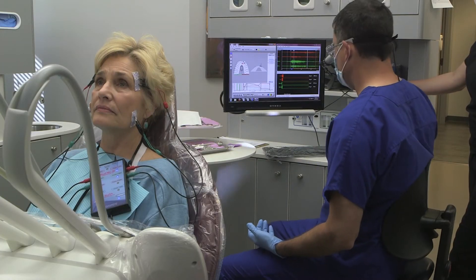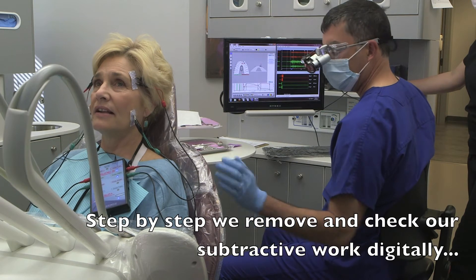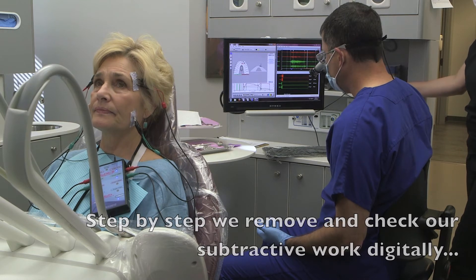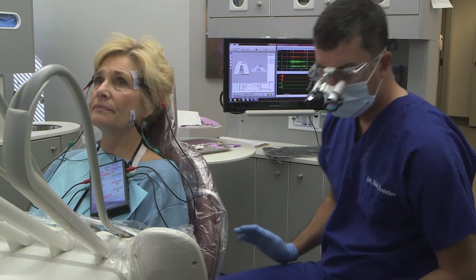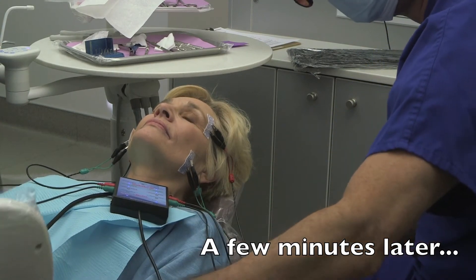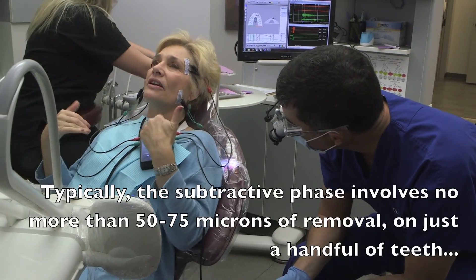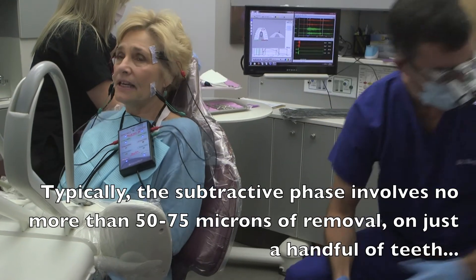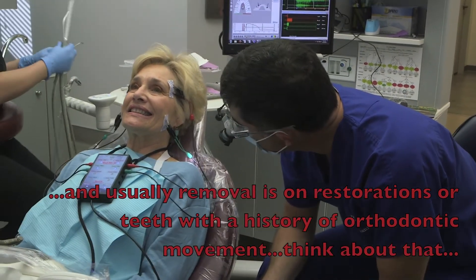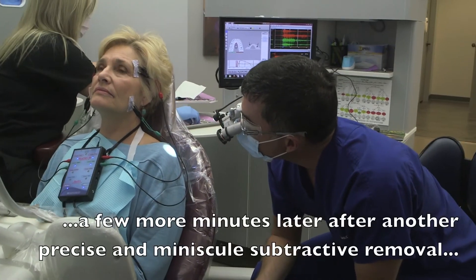Way better already. Does that feel any different? It was a little easier to slide over — I had a little more range there. Think about it — does it make sense that things are easier? My muscle doesn't have to work so hard. Does it feel any different? Yes, it does. Describe it for me in your words. It seems like my teeth are sitting down on each other more evenly. Yeah, just more comfortable. It just feels like my teeth are coming together even more so than before.